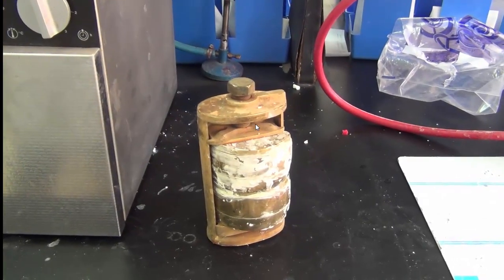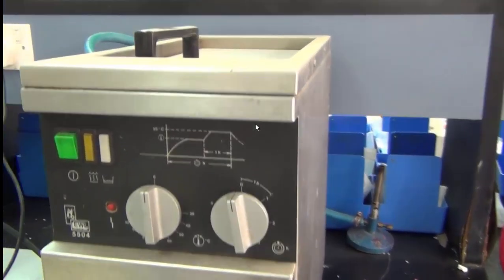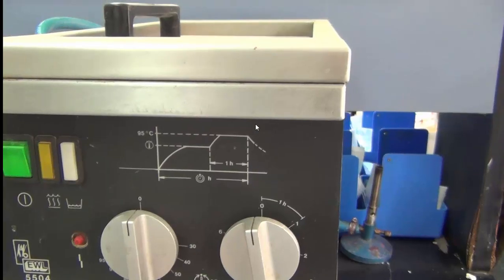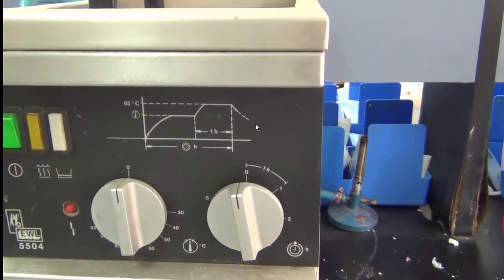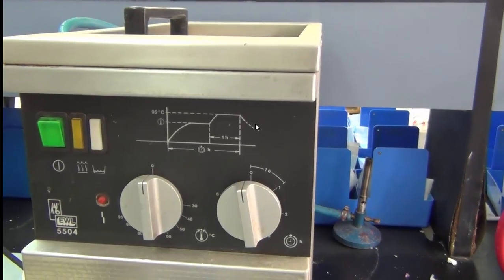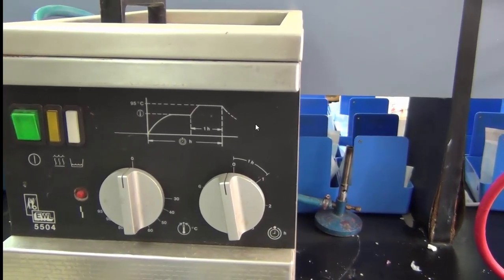Now that the flasks are ready for curing, we place them in this curing machine. We notice that the curing machine is like a water tank. It has controls for the temperature and the cycles, the time. So it controls the time and the temperature. I would like you to revise from your theory in dental material books what talks about the long and short cycles of acrylic. So we have different curing cycles of acrylic.